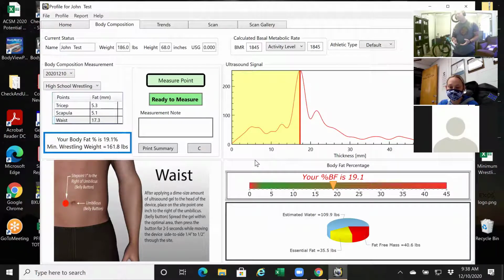It's not going to be a big deal to ask for their help. Have them pull it up so you can get to the site and then take a measurement. Now, this assessor said the reading on this particular kid was at 43 millimeters. So again, if we think about our depth scale here, that made sense based on his description to me, not even seeing this gentleman. But the assessor wasn't 100% confident, and I understand.